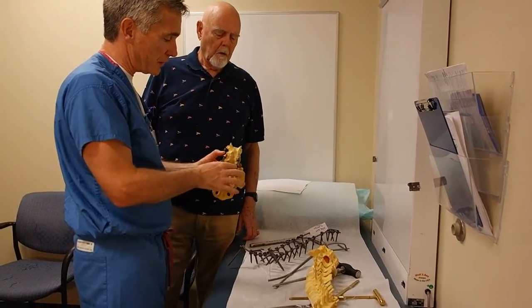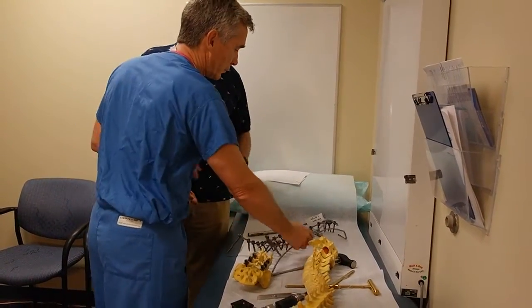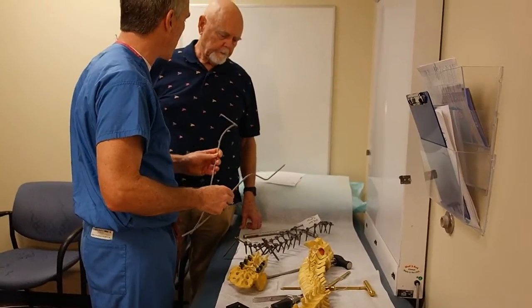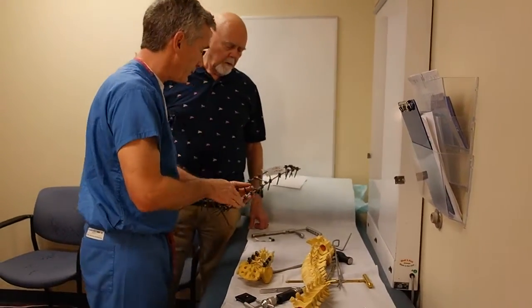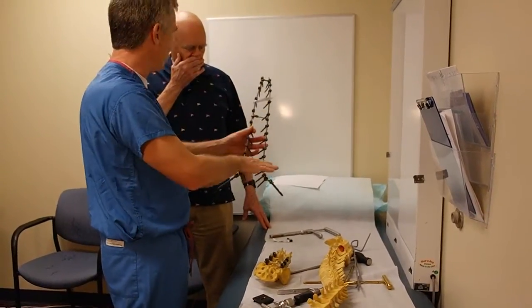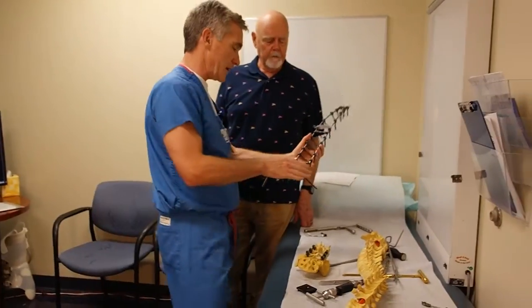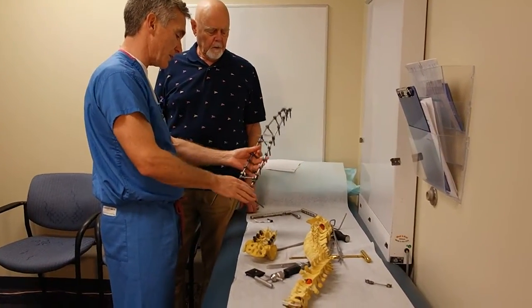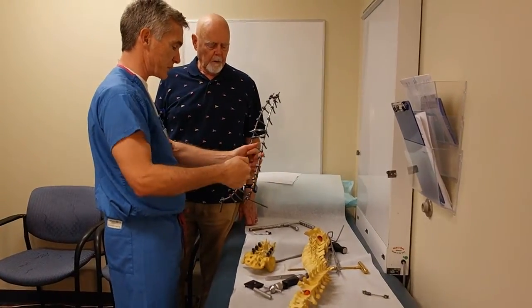So we get the screws in that way, and then we have all the anchors in. Then what we have to do is actually bend the rods to the shape that we want you to be. The rods come straight, but then we contour them so that you have your proper sway. We actually have the screws mounted on there. I do that bending myself in the operating room with some special benders.